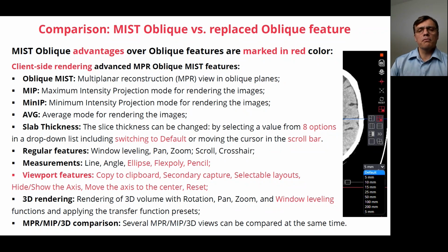So keep in mind, for this upgrade you need to back up your previous version very carefully, because if you'd like to return back, we will not have the possibility to return the Oblique licenses to you. Be very precise on backing up the old MedDream license which you upgraded.